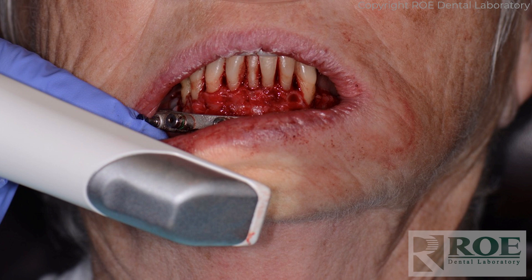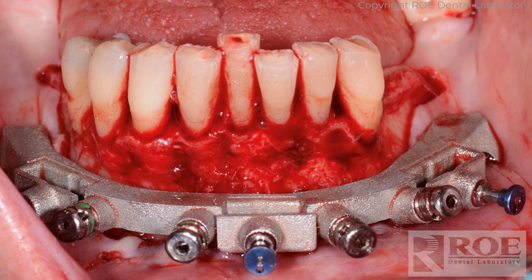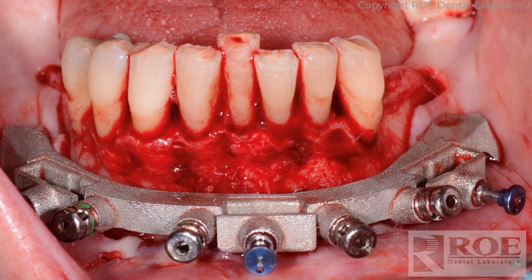At this point, you'll take a scan. The intention of this scan is to capture the fixation base, which is roughened to make it easy to scan as opposed to shiny chrome. Scan the facial, then the occlusal, and then the bone and the teeth. We do not need the opposing bite or all the land areas that you'd normally capture, because we already have the teeth and the bite back in the laboratory from making the CombiGuide. You must pick up the fixation base as a reference for the end of surgery.